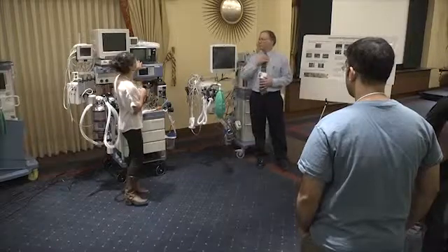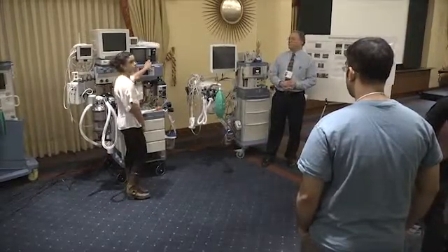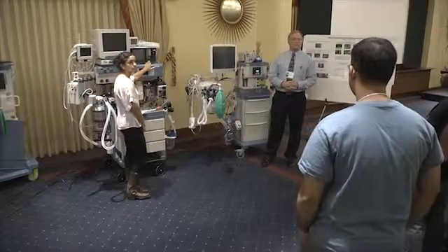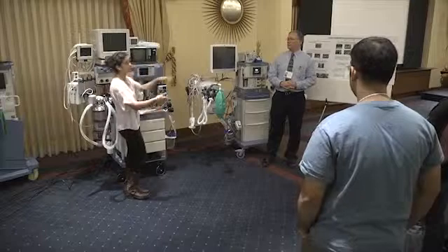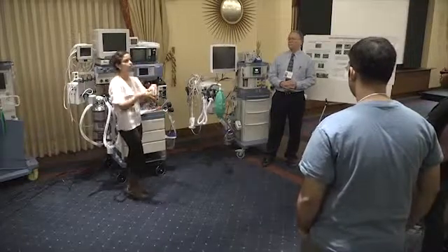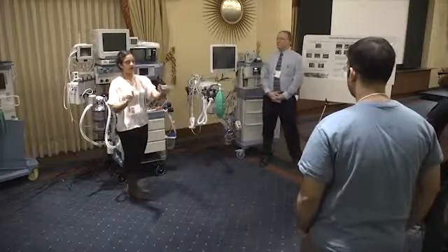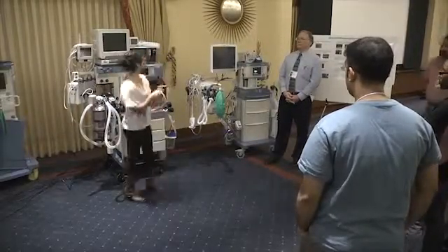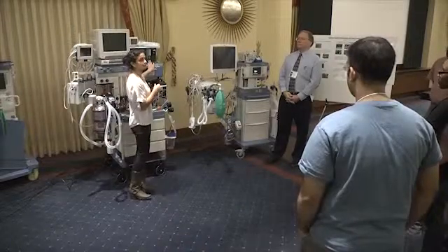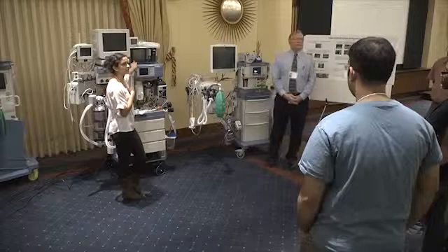Well, you guys know this monitor well, and if you don't remember to turn it on during your pre-checkout, you get in the room, put the patient on the table, move the IV bag, put the EKG on, all that stuff, and then you start pre-oxygenating the patient. Your attending looks over and says, "Oh, we don't have CO2." So then you turn this puppy on, and this thing takes like 4 minutes to warm up.